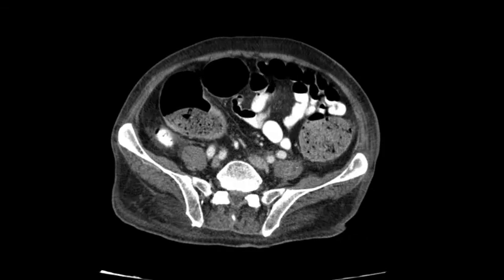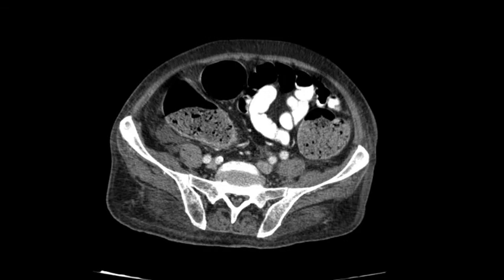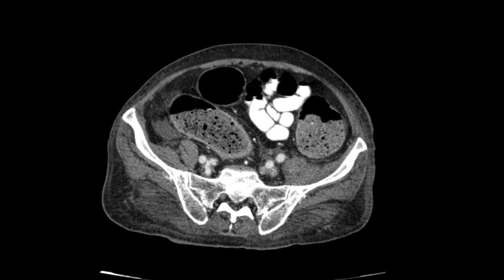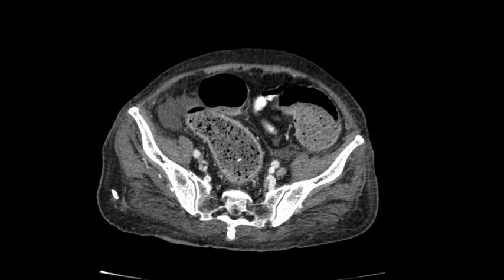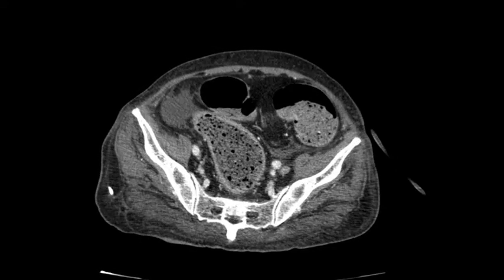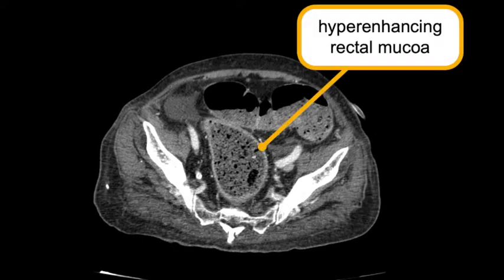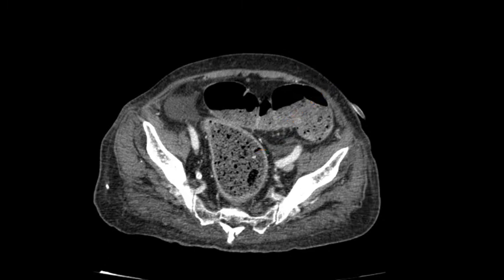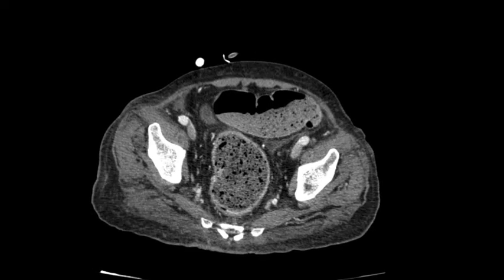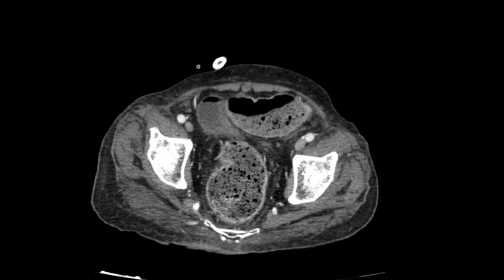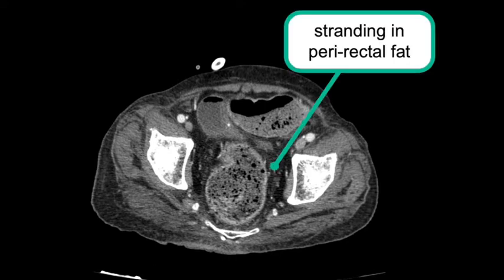The mucosa of the colon has normal enhancement, but as we reach the rectosigmoid and rectum we can see that there is hyper-enhancement of the mucosa, and there are also strands of gray color around the peri-rectal fat — called stranding — signaling that there is some inflammation here.